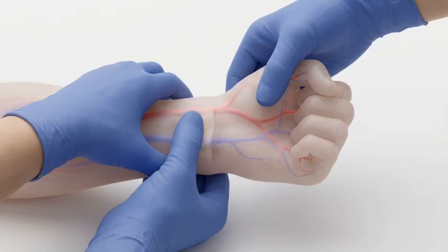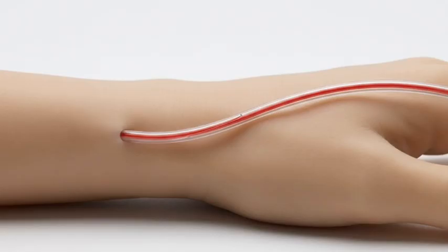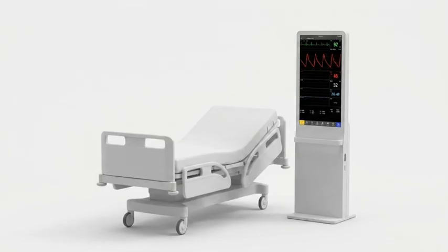Before committing to any puncture at this site, you must assess the hand's collateral circulation to confirm that blood flow will remain adequate if the radial artery is temporarily compromised. Because the radial artery runs relatively superficial on the thumb side of the wrist, it provides an ideal, accessible site for continuous pressure monitoring and blood gas analysis without risking deep tissue damage.